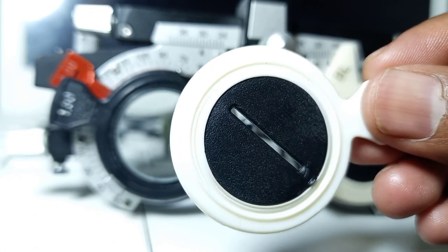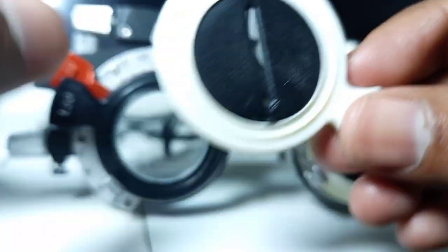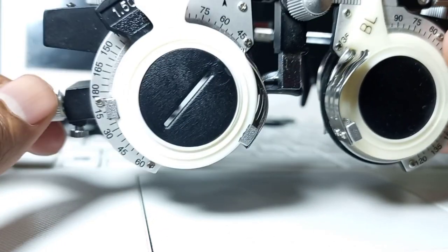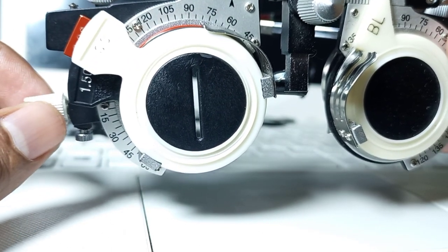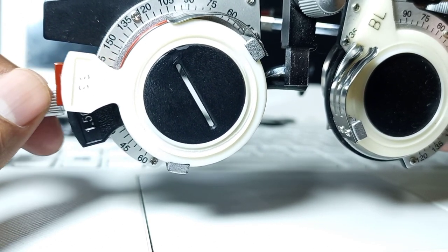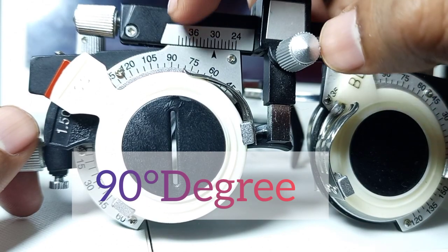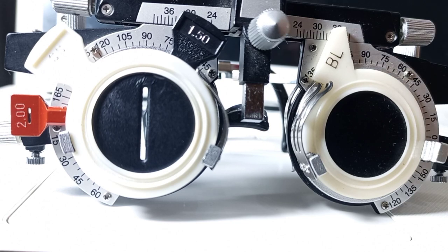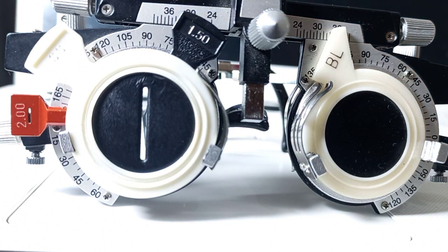Now we will place the stenopic slit before the patient's eye and rotate it 360 degrees. We will rotate it gradually and ask the patient at which axis the visual acuity is getting better. Suppose our patient prefers when the stenopic slit is coinciding with 90 degrees — this is our first principal meridian.